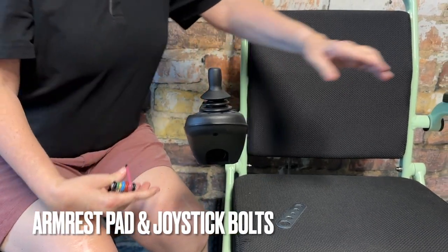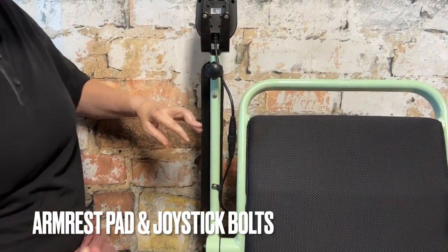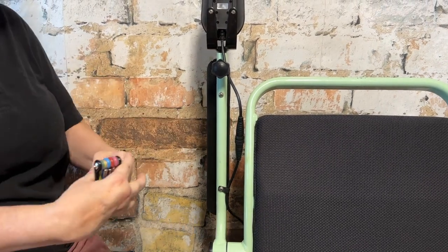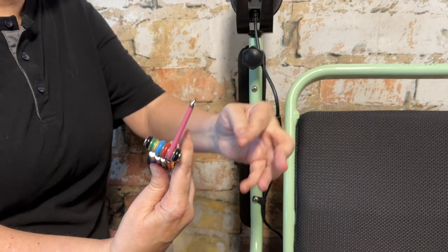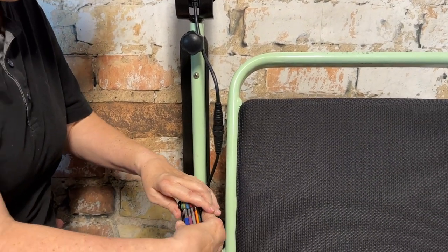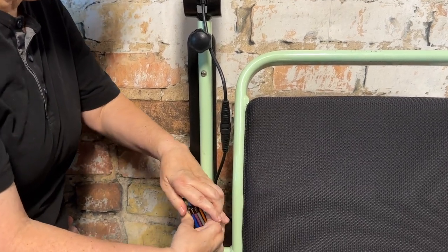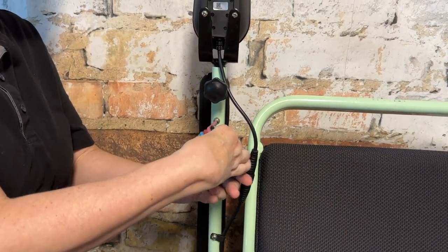Next, we're going to tighten the armrest pad and joystick bolts. Flip up the armrest — you'll notice the two bolts that attach the armrest pad to the frame. Take your Phillips head pink tool and stick it into the head of each of these two screws. Righty tighty, lefty loosey to tighten them in place.